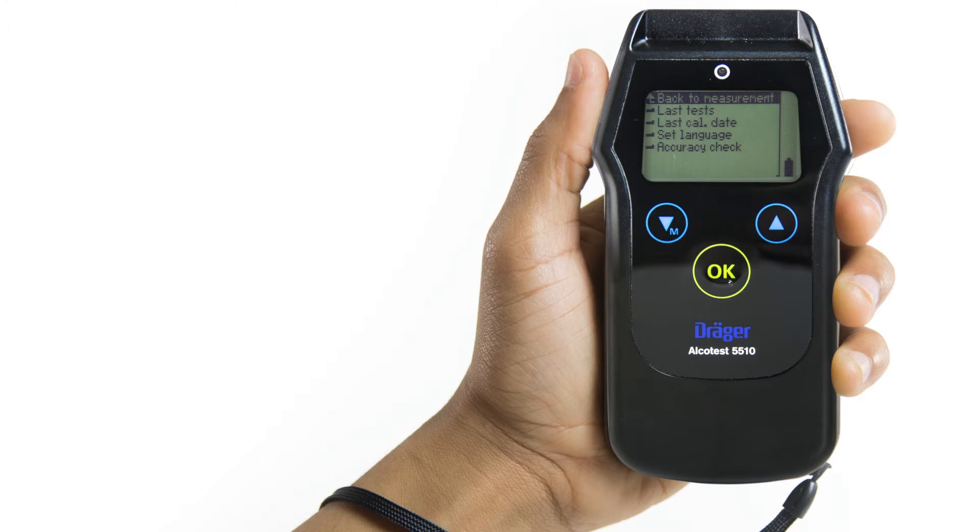The Back to Measurement at the top of the menu will return you to Ready where you can perform a breath test.